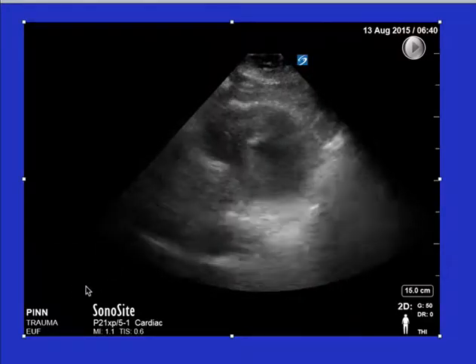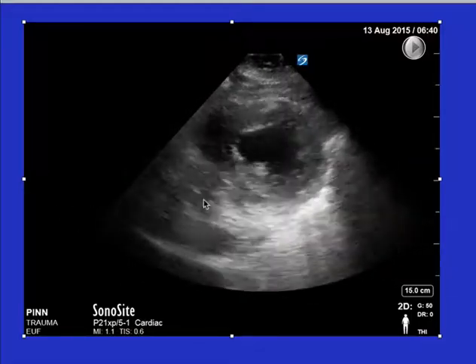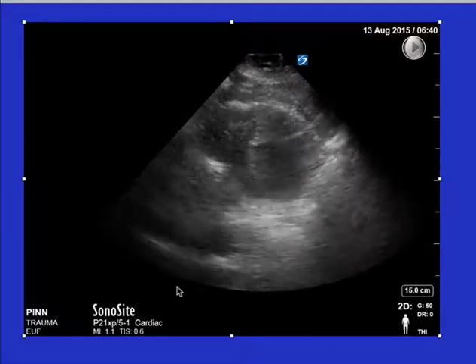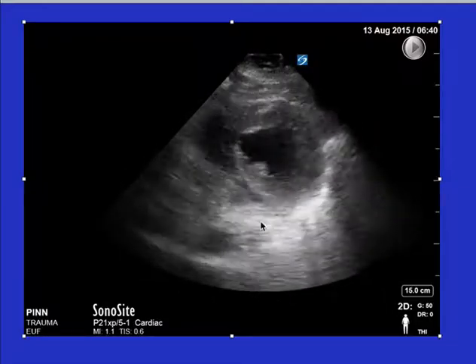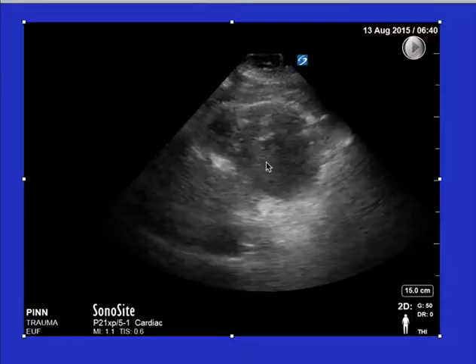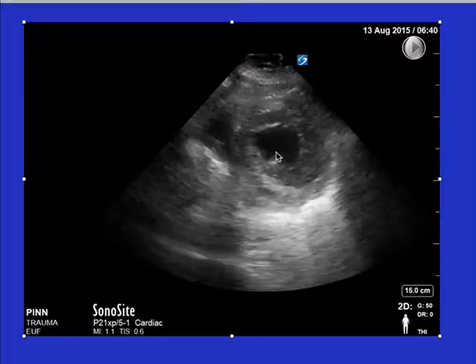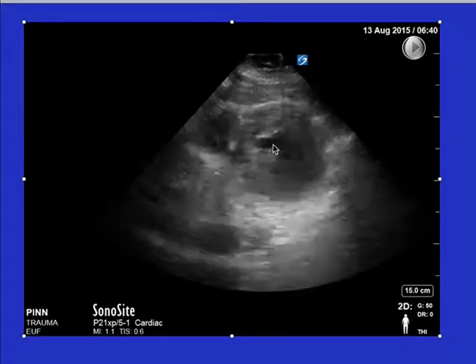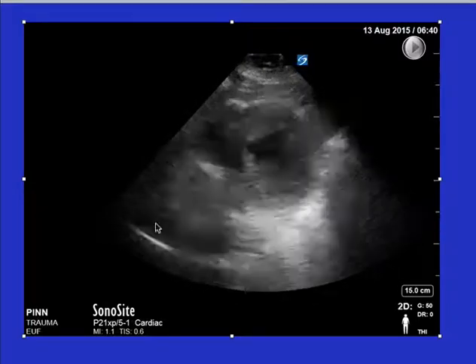Here you see a patient that's not only tachycardic, but probably, if you have the right clinical scenario, was in hypovolemic or septic shock, either from hemorrhagic shock or from an infection. So again, you can see the right ventricle, the left ventricle. You can see the papillary muscles. And you can see total obliteration of the cavity every time the heart beats. So this would indicate, after you look at the lungs, if there's no fluid in the lungs, that the patient may need more volume.